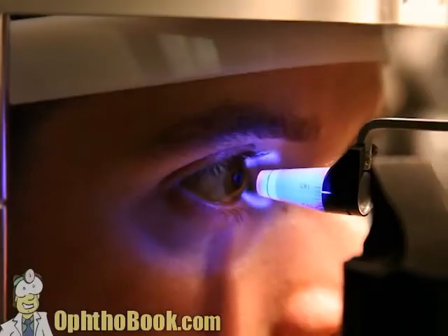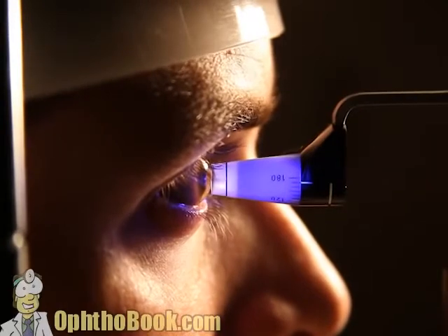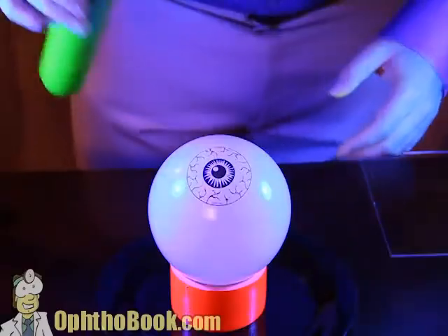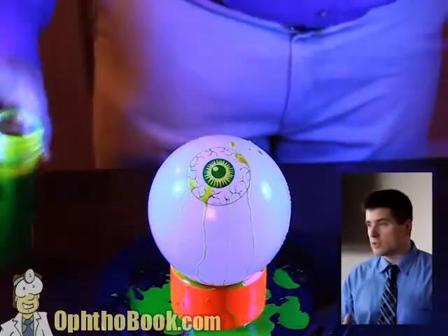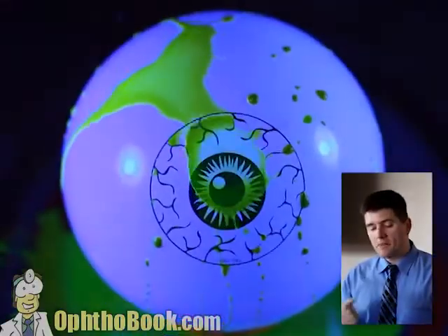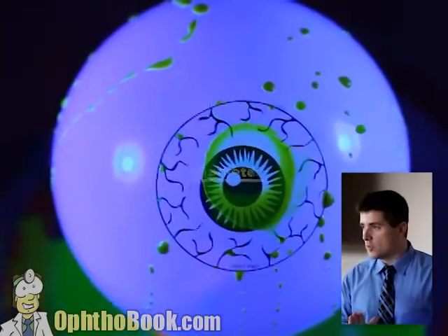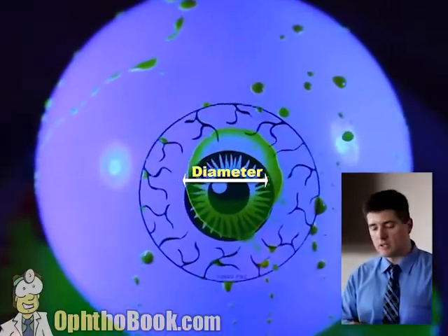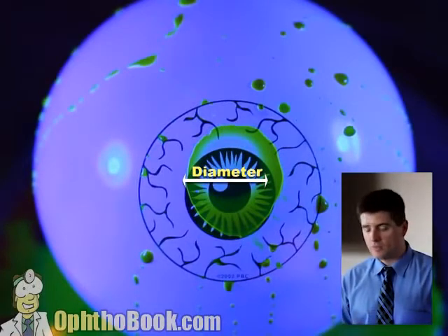which is when we light up our blue applanation tip, we push it on the surface of the eye in order to estimate the internal ocular pressure. And the way it works is if you have a thin-walled sphere and you push on it with a certain amount of force, the amount of force you use and the area that becomes flattened, which we can measure by looking at our fluorescein mires here, can be used to calculate the internal pressure inside that sphere.